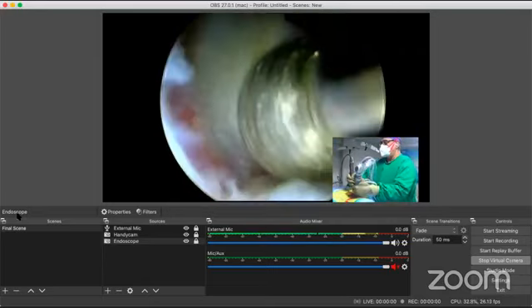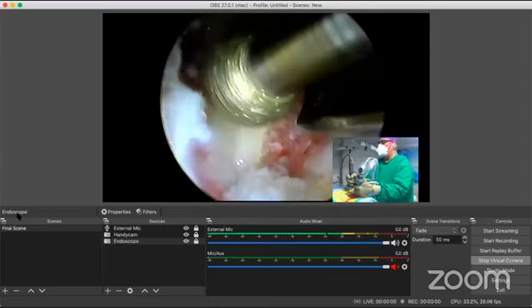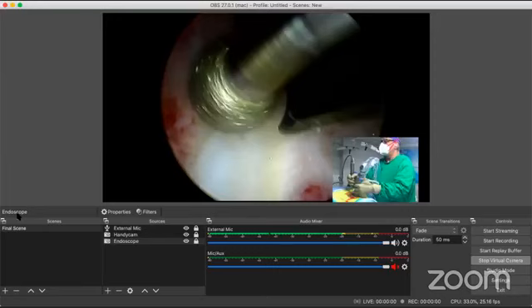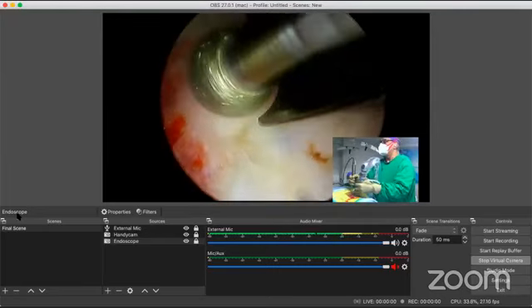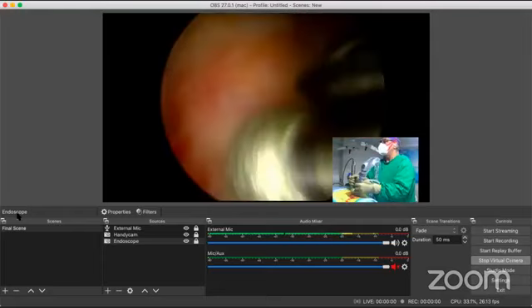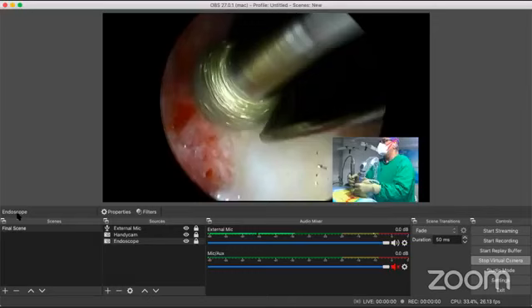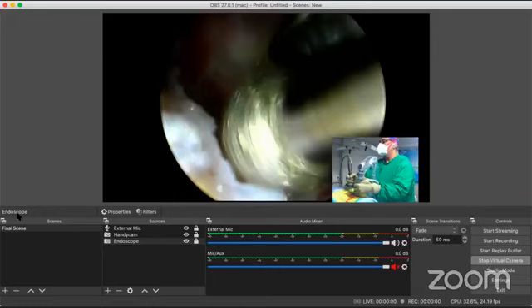Now this is why I told you, okay, it's very important to mark your lower limit, because you never know where your lower limit is subsequently. You tend to lose direction. Okay, so that should not happen to us. We want now, we are burring towards the lamina. This is towards the center. Okay. My root is flowing here.